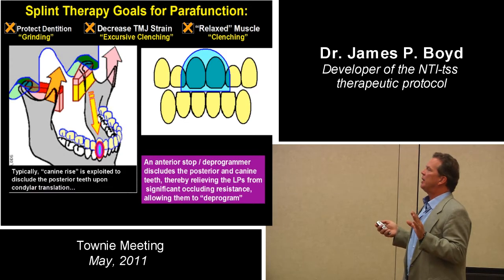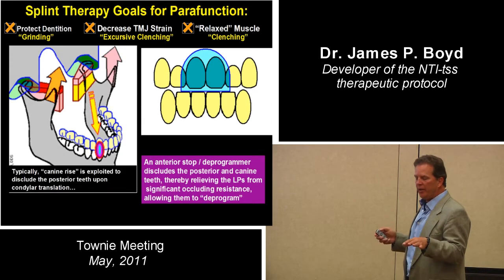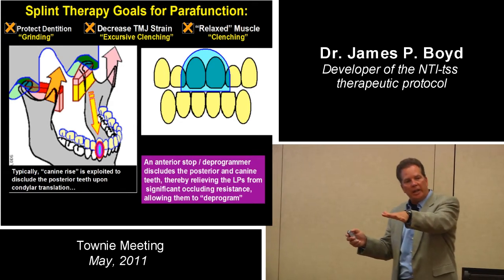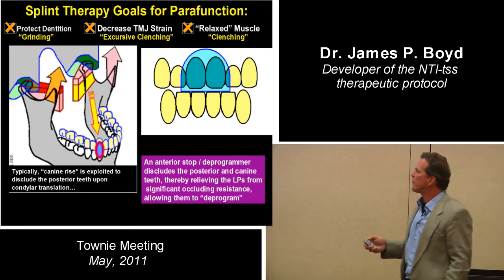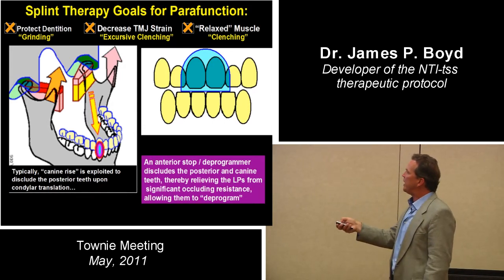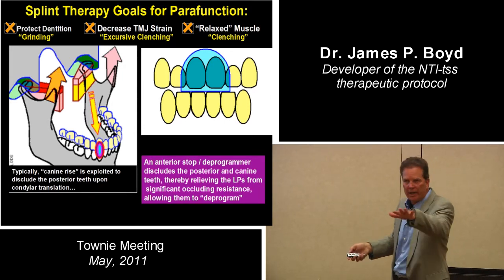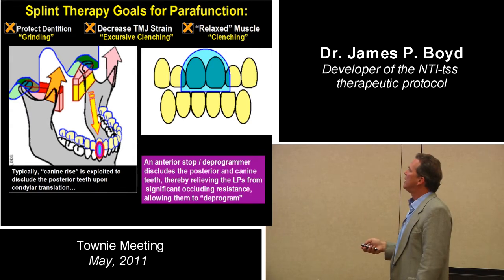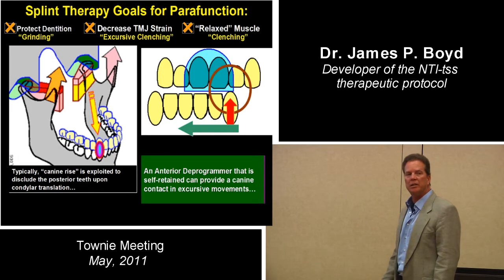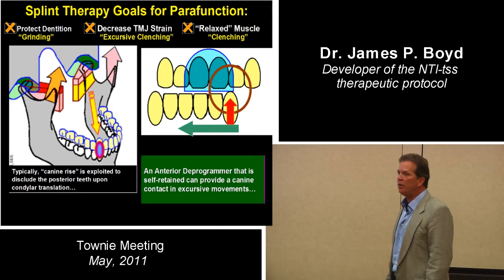We typically are assuming at night that we want canine rise. So we know after someone clenches or bites, they grind to the side. If they're wearing a deprogrammer like that and they grind to the side like we expect them to do at night to go to canine rise, it's not unusual for the opposite canine to engage the jig. It's not hard to do.